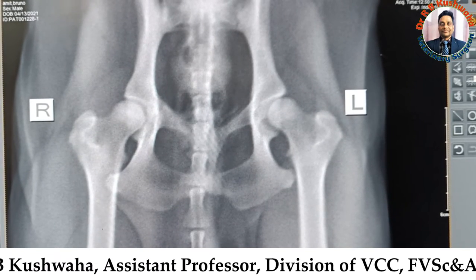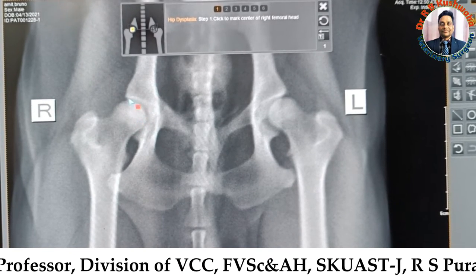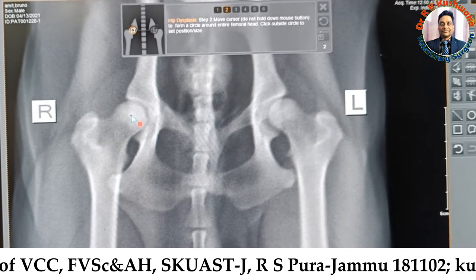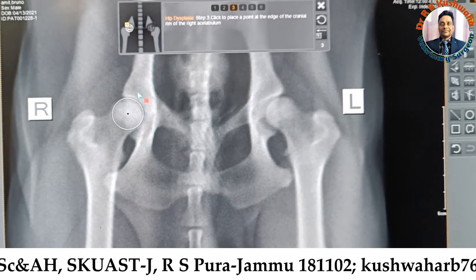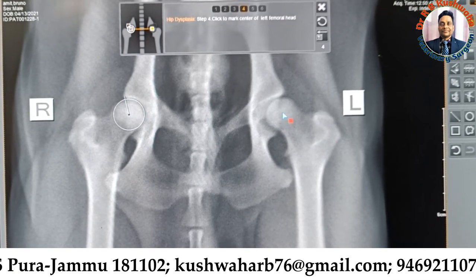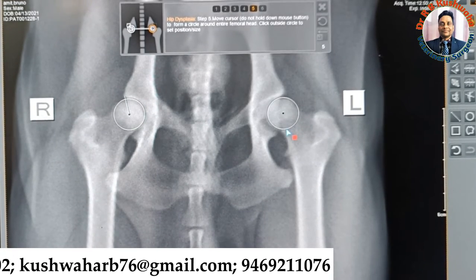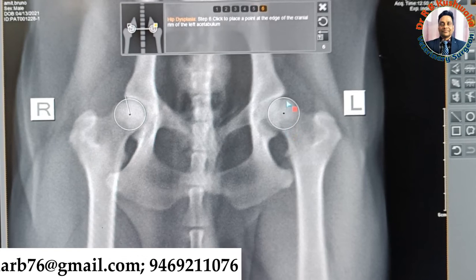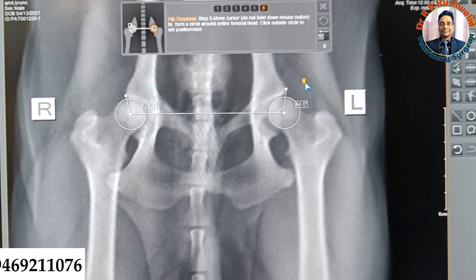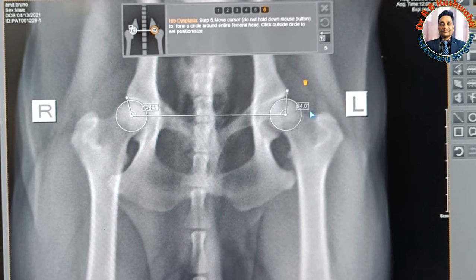I select hip dysplasia. Now I take the first diameter of the right side of the femoral head, starting from the center of this femoral head, and then mark at the cranial acetabular angle. Similarly, we take the diameter of the left side of the femoral head and then mark at the cranial edge of the acetabulum. Now it gives the picture of the Norberg's angle.